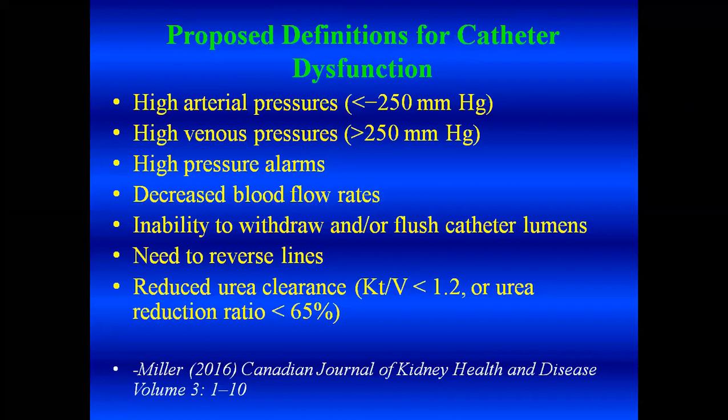If we get frequent high pressure alarms, or we aren't getting the blood flow, we need to investigate. This is something we need to have a protocol for within our unit: if the nurses frequently reverse the lines without informing anybody, it could be a long time before you find out that there is a catheter malfunction, and by that time it may be too late to intervene safely within the dialysis unit, and it might need specialized intervention. So if a nurse is reversing lines, it's important that she inform the resident doctor or the nephrologist in the unit so that they know that a catheter malfunction has started.